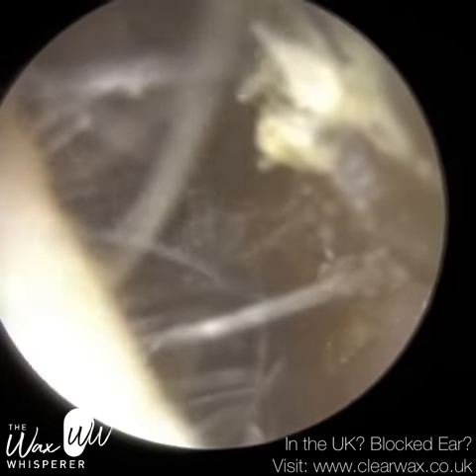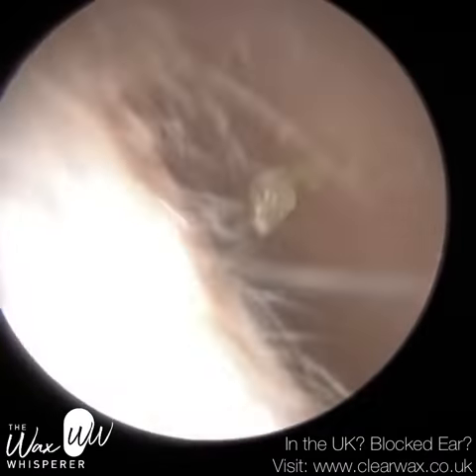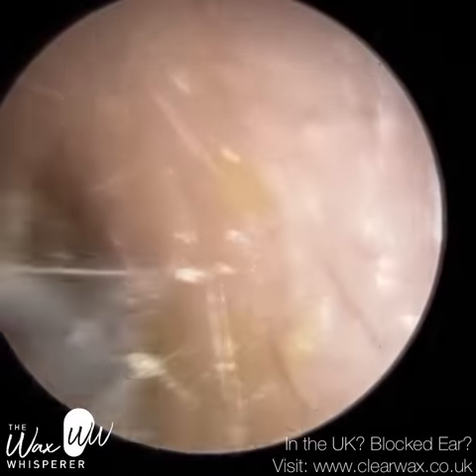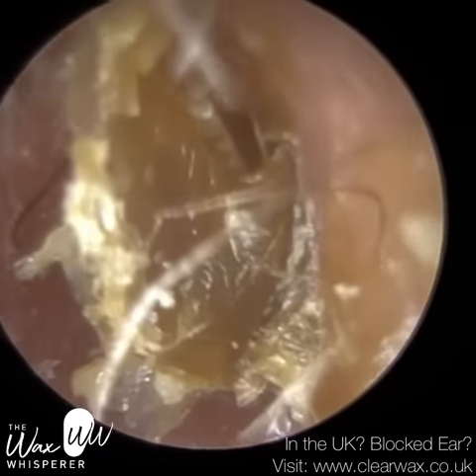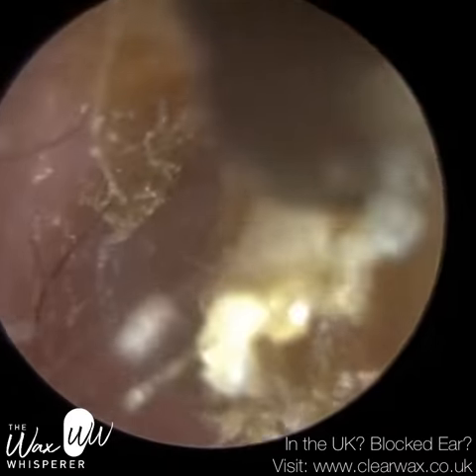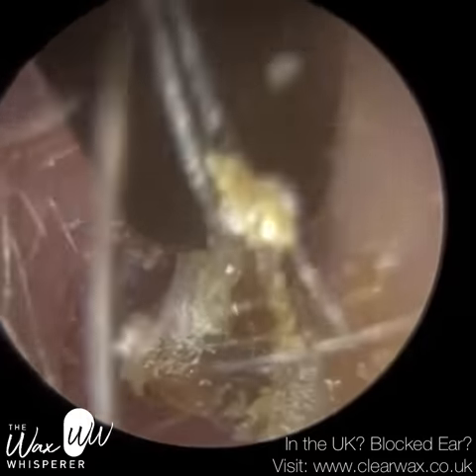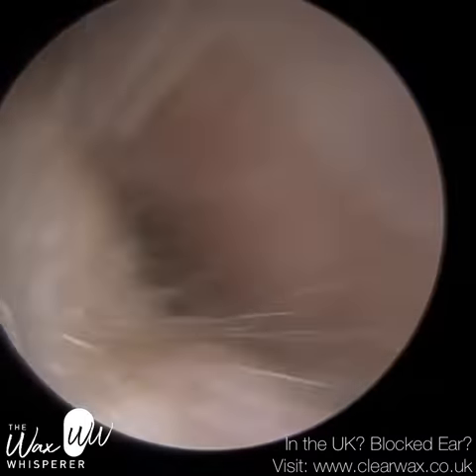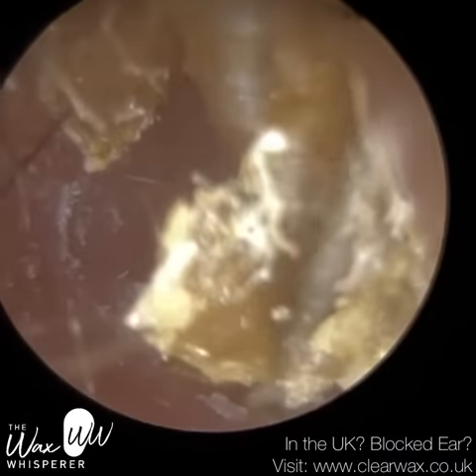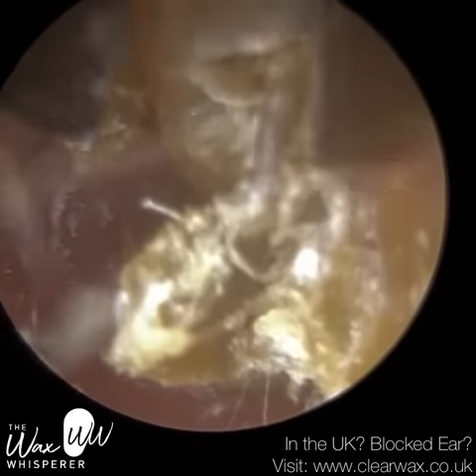So this is the patient's right ear — I did actually start off with this ear and then progressed to the left ear. Whenever I know a patient has an infection in one ear, I always start off with the non-infected ear, because it saves us from having to sterilise — decontaminate — the endoscope between ears. If I'd started with the left infected ear, I would have had to decontaminate before entering the right ear. So we start with the non-infected ear and then progress to the infected ear.